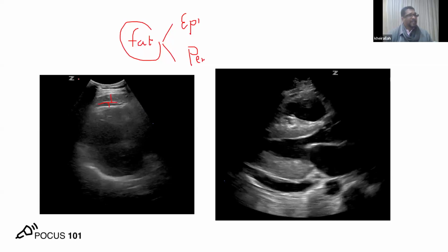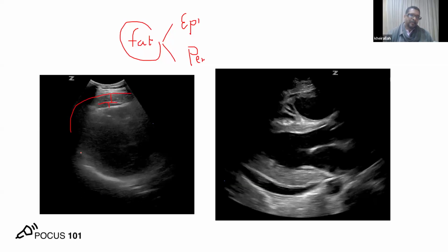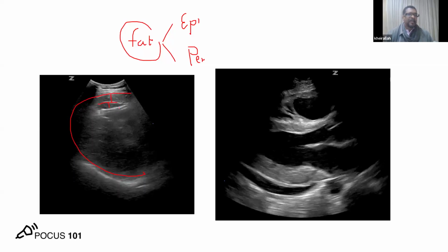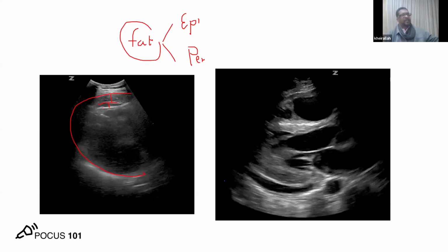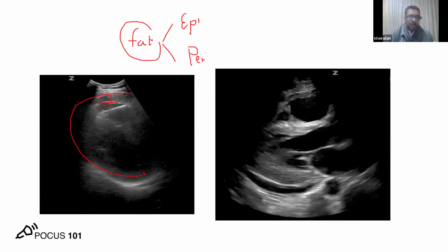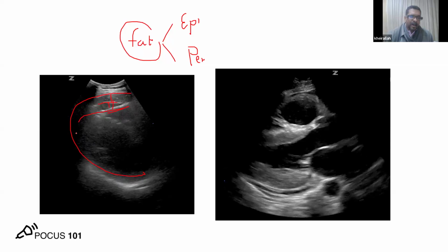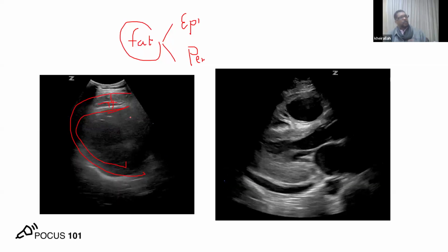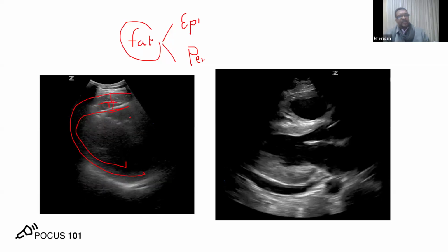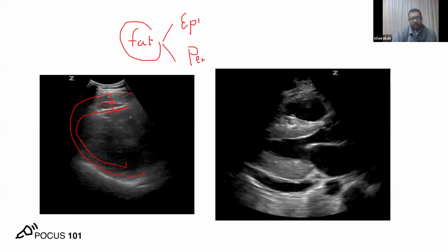because of the fat. يعني chest x-ray is gonna see all this. Doesn't distinguish between the wall and the fat. So it appears in the chest x-ray as big, while in echo, you are gonna separate the wheat from the chaff, so you're gonna see the heart proper and the fat. So you know which is which. ولذلك the chest x-ray is misleading in terms of LV size assessment for so many reasons.